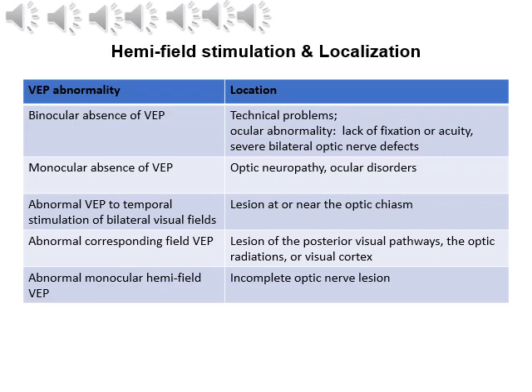And so if there is an incomplete lesion of the optic nerve, what would be seen at the VEP is quite specific. And so first it would be specific to the eye that's affected, and then there would be an asymmetry in the lateral VEPs where the side that is affected would correspond to the side of the optic nerve that is lesioned.